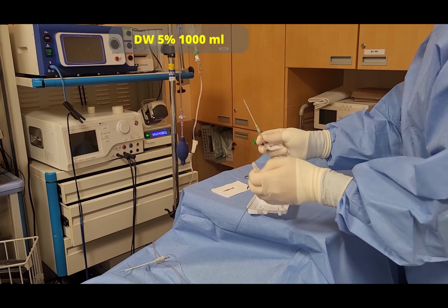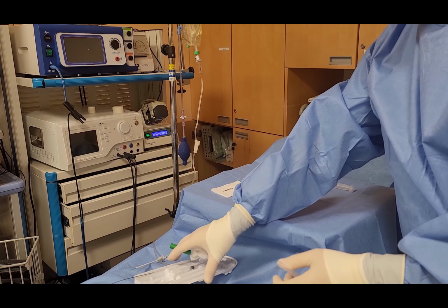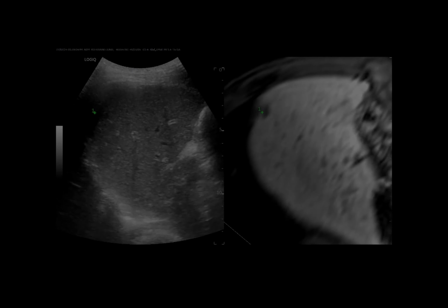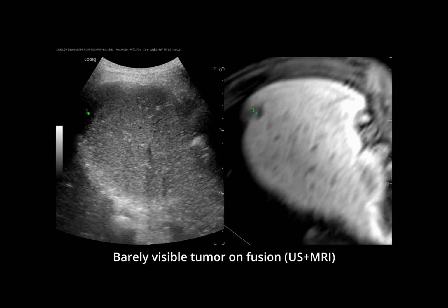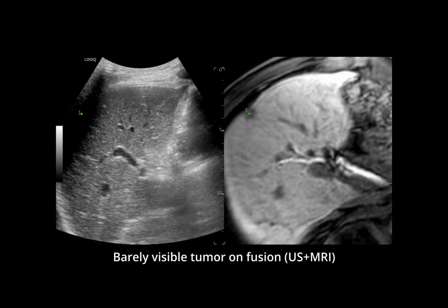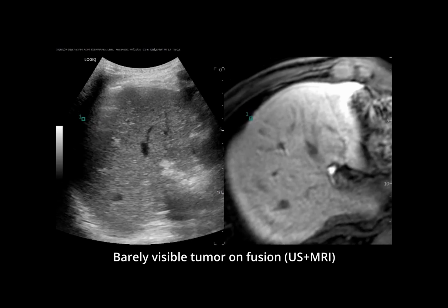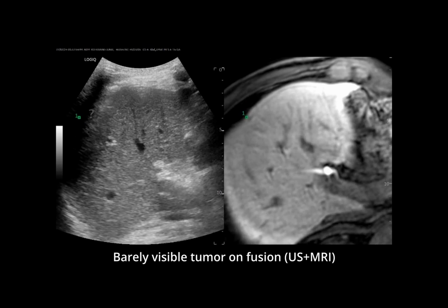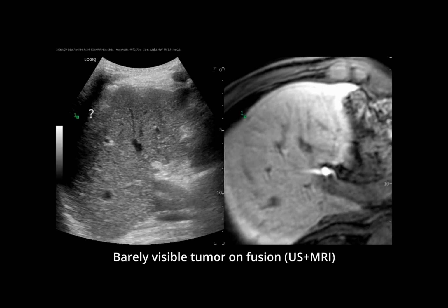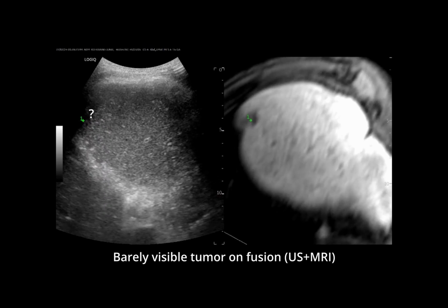But a big difference is that we prefer the angiography introducer sheath rather than a spinal needle. And then, on ultrasound after fusion, as we can expect, the lesion is barely seen on ultrasound due to overlapped lung shadow. So to improve the sonic window, we have to use artificial ascites.